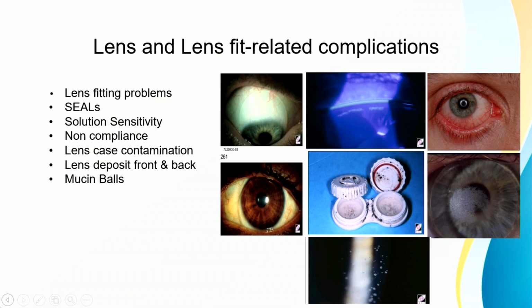So you can just find out how they are maintaining their lens case. Even some patients have a box where they keep the lens case. That box will even be dirty. There will be dirt all around, and we need to change the box itself. So we have to really look at all these points, not only the lens fit alone.